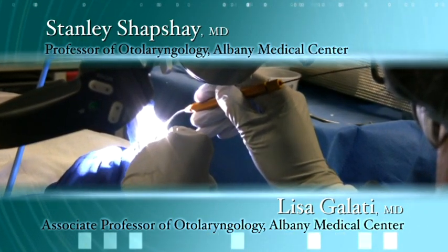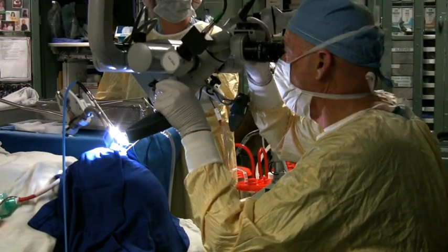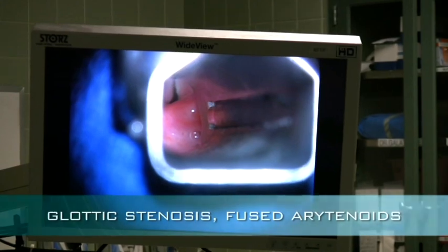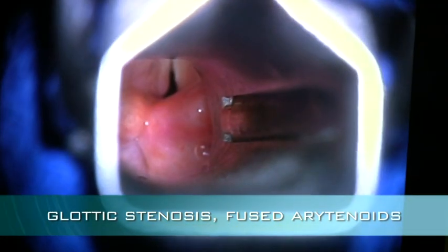The procedure today is actually a very difficult operation on a patient who has a glottic stenosis. She has scar tissue between the arytenoid cartilages from a prior intubation. She was rather sick in the past, required repeated intubations, and was on the respirator for a while. Now she has what appears to be fused arytenoids and needs another procedure.